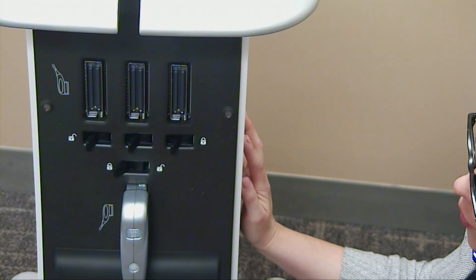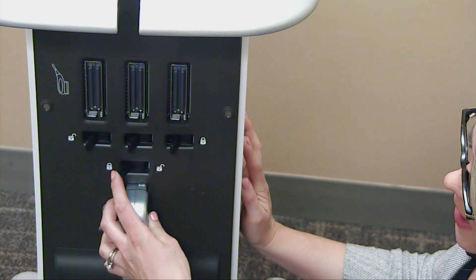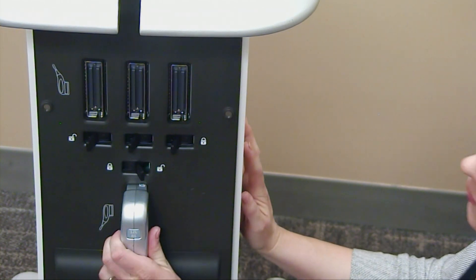To unlock your probe, press your lever towards the opposite side, towards the unlock icon, and release.